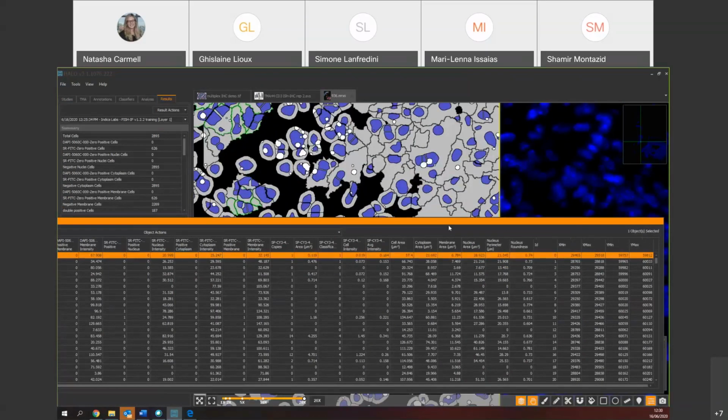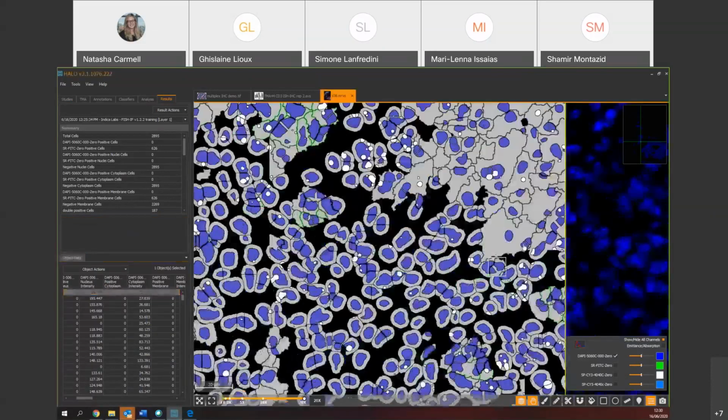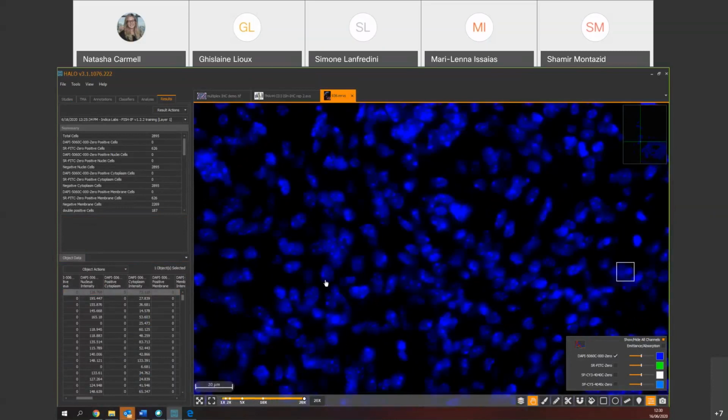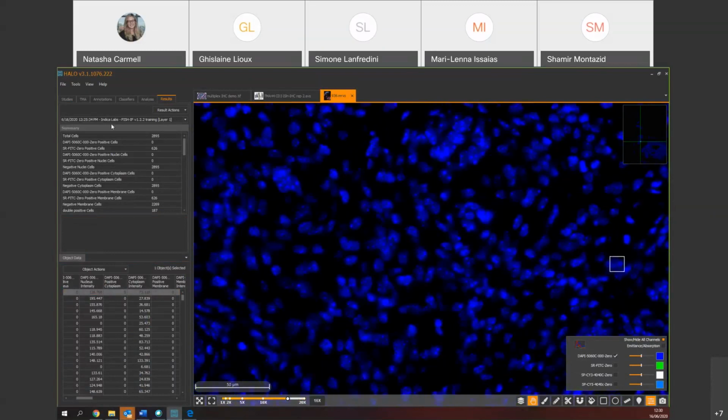Okay, my last question is, if I have a lot of images that I want to batch process, obviously I'm doing all my tweaking with my first image, but then can I run it on the whole batch, or do I have to tweak each and every image? Well, you will have to judge if your images are actually similar enough. But you can definitely run your parameters.